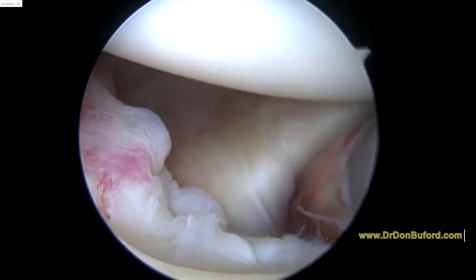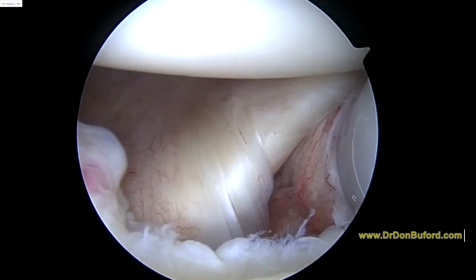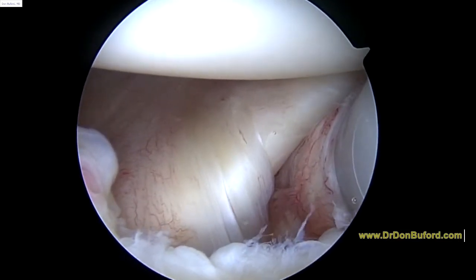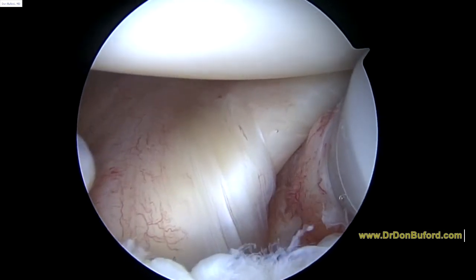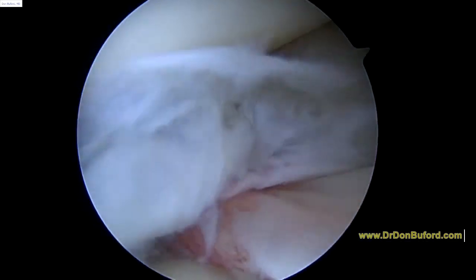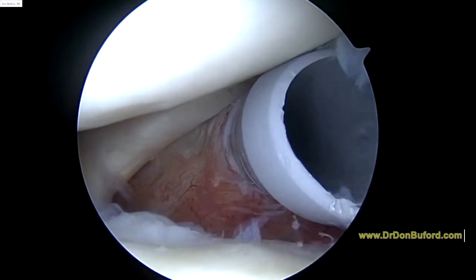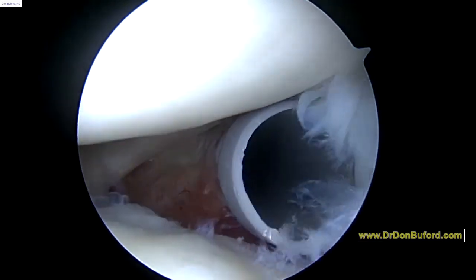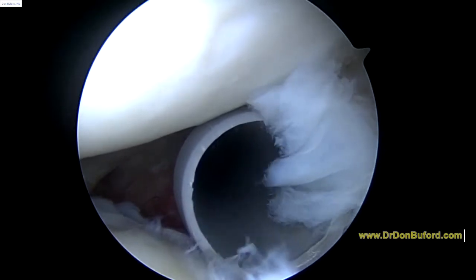We're looking at the part of the shoulder in the front that we call the rotator interval. You can see the subscapularis tendon going up to the right towards 1 o'clock on the screen. And then crossing that from left to right is the middle glenohumeral ligament. What's interesting is we see all this tissue here where we normally see a biceps tendon, and we just don't see any kind of normal anatomy yet.